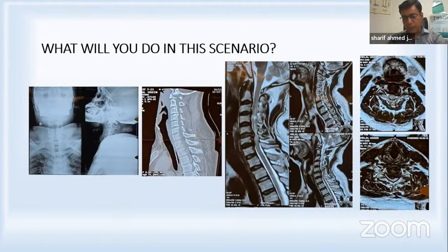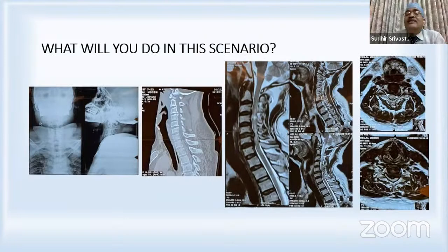Yeah, actually such types of injury are whiplash injuries. And that is the reason, if you don't find anything in the plain X-ray or CT, MRI is important to see any soft tissue or ligamentous injury. Yes, there may be soft tissue injury and whiplash injury. It happens. So there is a concussion of the spinal cord. The rest of the radiology looks normal, but you can see significant signal changes in the cord.